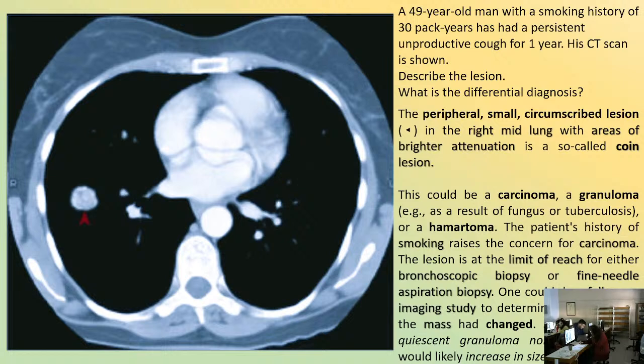What would that be? It would be to look at it in the microscope after centrifugation. What's that? Centrifugation. You take the fluid, you centrifugate it, and then you take what is left and make a slide. Make a slide and put it in the microscope. This is a cytological smear, because these are exfoliated cells from the lesion. And if you see a malignant cell, you say it's positive.